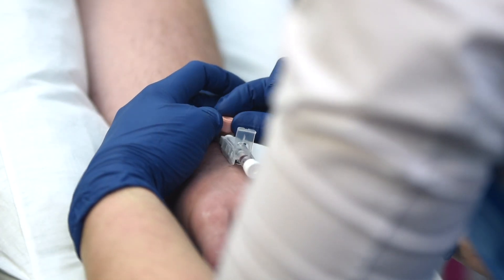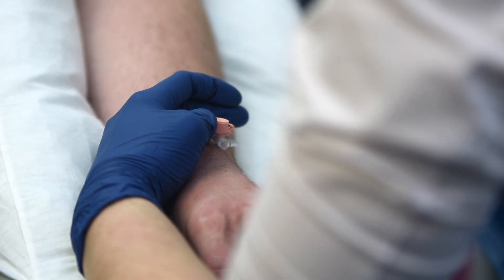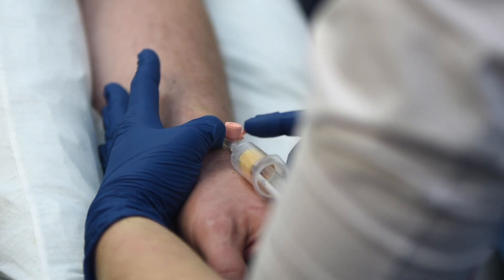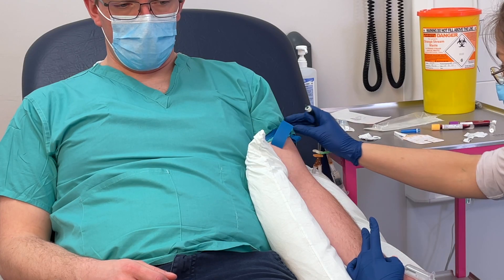Place your finger over the distal part of the cannula to close the vein so that you don't get blood coming back. A little bit of blood is fine and is to be expected. This is the point where you can now take blood off the back of the cannula. You can either use a syringe to do this or use the vacutainer adapter and bottles just as you normally would if taking blood. Once you've got all your blood samples, remove your syringe or adapter and take off your tourniquet.